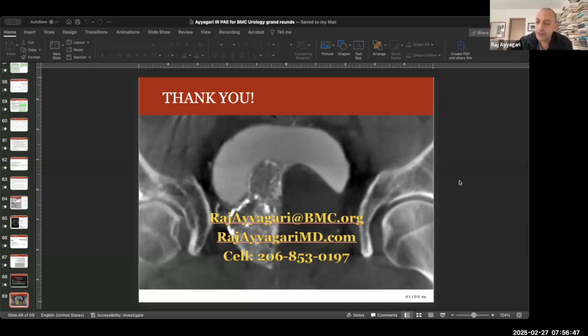Well, we actually didn't do a good job in that case. I didn't mention it. He was the guy who had that area of non-target embolization on the tip of the penis. Because of his atherosclerotic disease, we did not see flow to the penis from anywhere else. And so we left it alone and just tried very carefully to inject the beads very slowly, very gradually, to try and prevent things from going down there. And usually you'll see that in the majority of cases, and Fabian can also attest to this, those connections will be there and you have to be very careful.